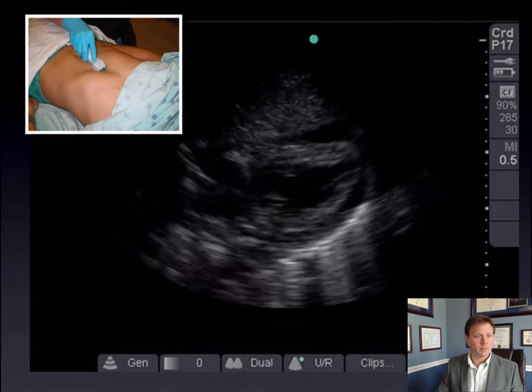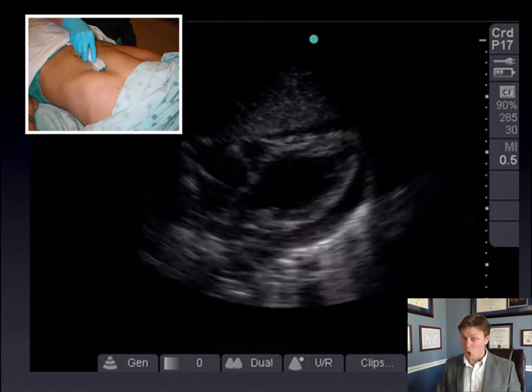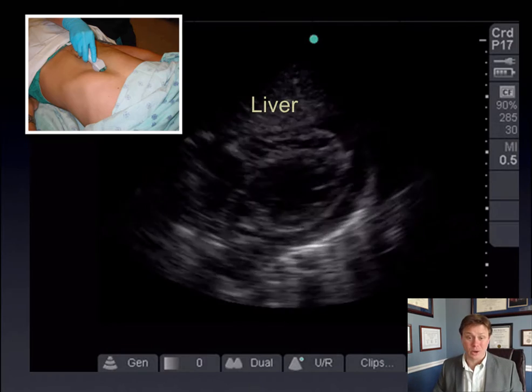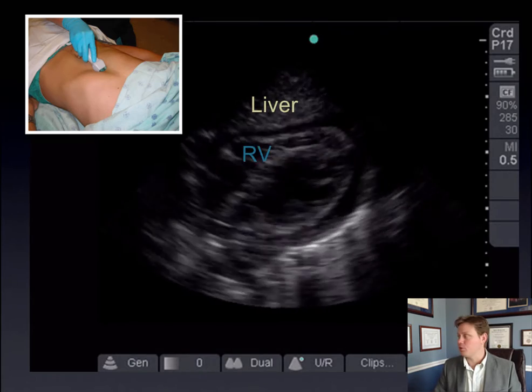So in this first example here, we've got a subcostal view of the heart, and what do we see? Free fluid, right? And actually a large amount of free fluid because we see it wrapping all the way around the apex. And what's more than that, we see collapse of the right ventricle. So this patient is in tamponade. From whatever reason, he's got that free fluid or bleeding in his pericardial space.